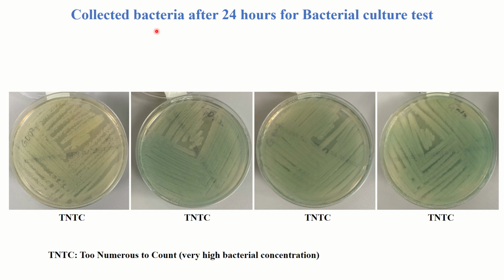This is the bacteria collected after 24 hours for the bacterial culture test. After we induced the bacteria, we collected bacteria from each rat eye to check whether the bacteria were still available on the eye. We checked at the bacteria lab in Suchi Hospital, and they reported too numerous to count for each group. I mean that there is a high bacterial concentration in each group's rat eyes.